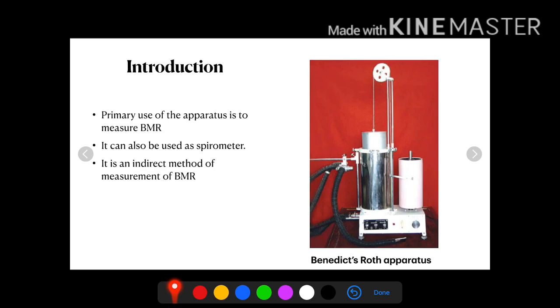Now this instrument can also be used as a spirometer. For use of this instrument as a spirometer, some modifications are to be done, which will be discussed later on.